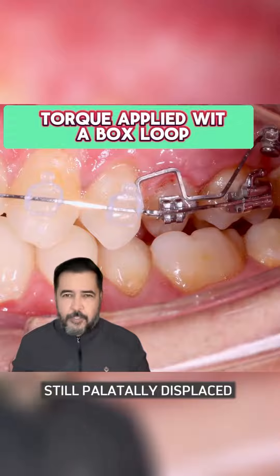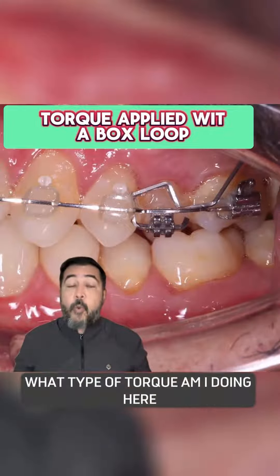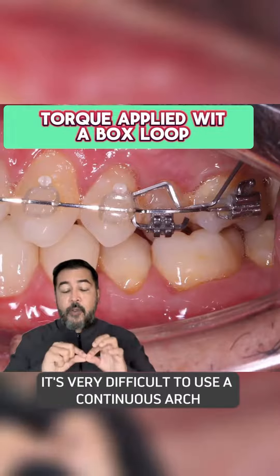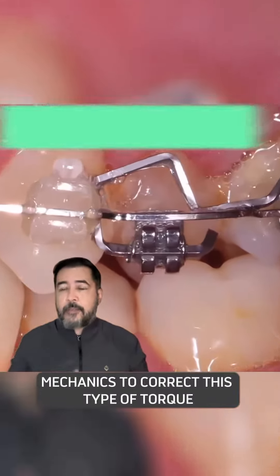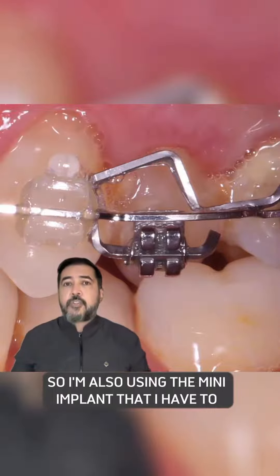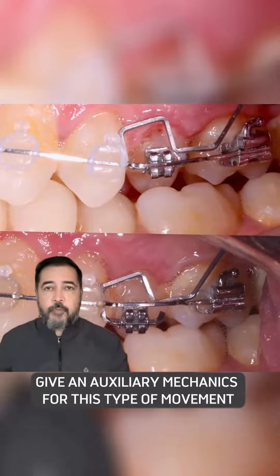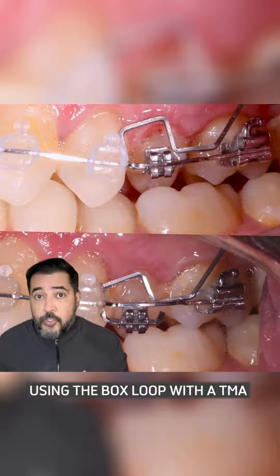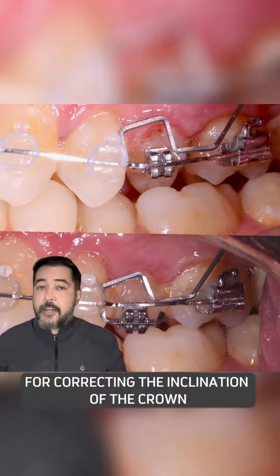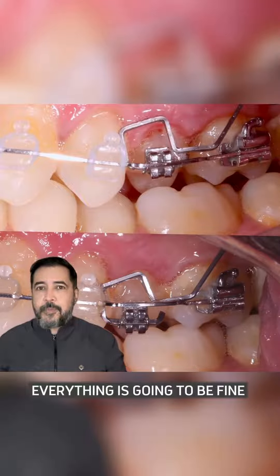The root is still palatally displaced, so I will need to do a torque. It's very difficult to use continuous arch mechanics to correct this type of torque, so I'm also using the mini implant to provide auxiliary mechanics for this movement — using the box loop with TMA to correct the inclination of the crown. After a while, everything is going to be fine.